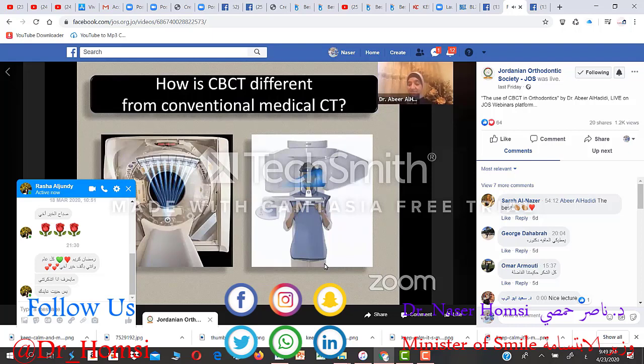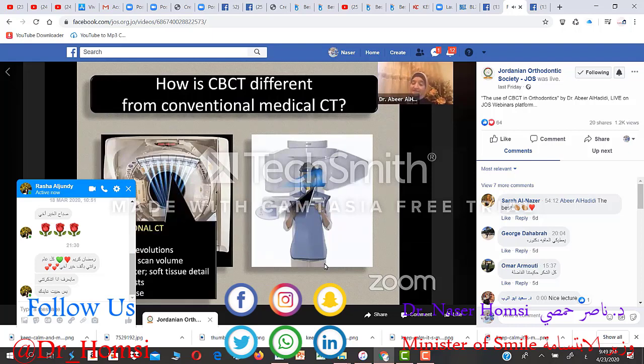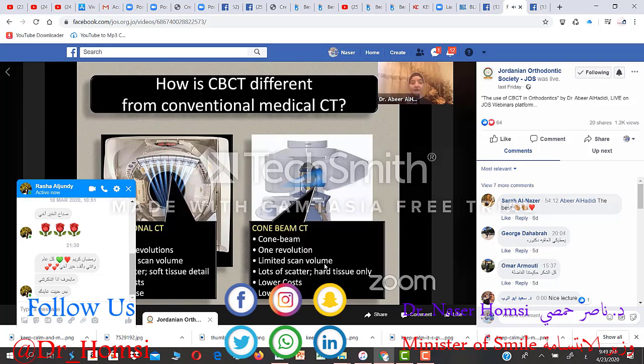There are some technical differences between conventional multi-detector CT and a cone beam CT that would be relevant in the use of CBCT in the dentoalveolar area. Multi-detector CT would use a fan beam, which means it would take a slice per slice individually. On the other hand, a cone beam CT will use a much larger X-ray source, meaning you are taking the whole head and neck area in one rotation. We will return to this in specific, but let's start talking about radiation biology with those aspects of both technologies.